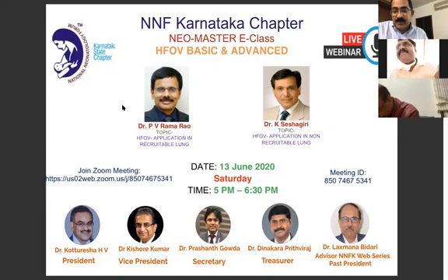Even delta P, what Satish Ganta told is very clear. It depends only on power, because if you use the Dräger 8000, it does not have the power, so you might need a delta P of 100. If you use the other ventilator, 60, 80. But to tell you very frankly, I never used more than 35 to 40 in my life, even with a stone lung, a very hard lung.